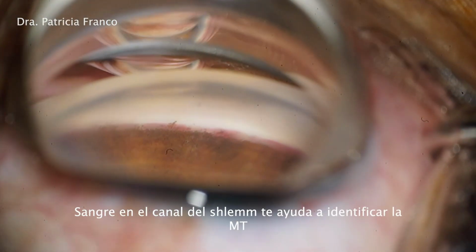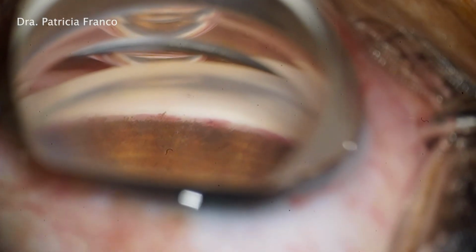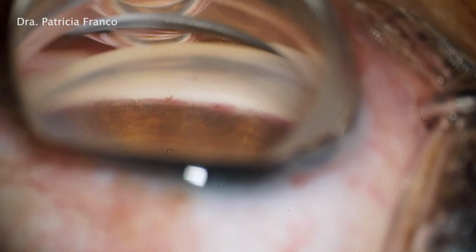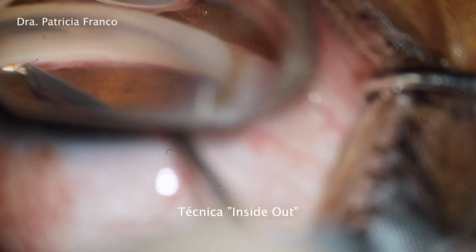In this case, you can see blood in Schlemm's canal before the procedure. This helps you identify the trabecular meshwork. I then enter the anterior chamber with the cystotome and I am using an inside-out technique.